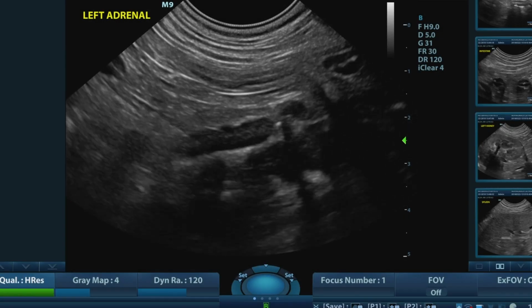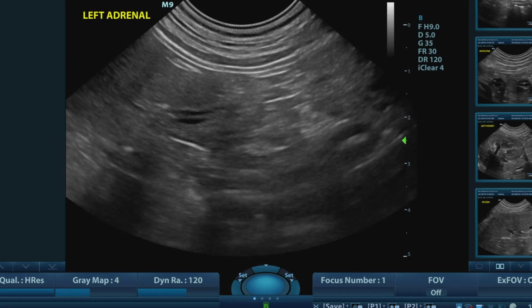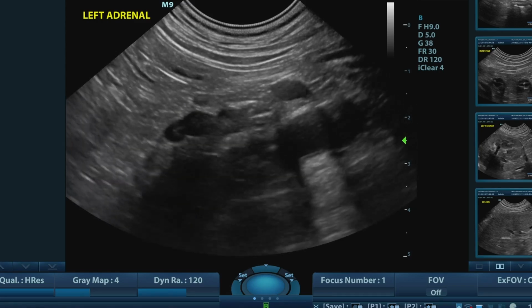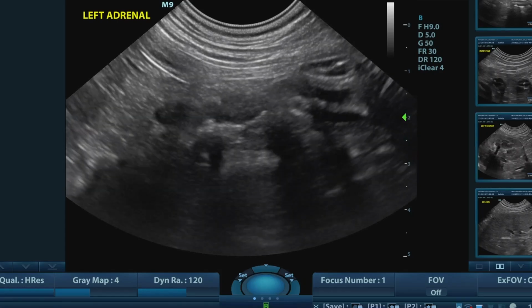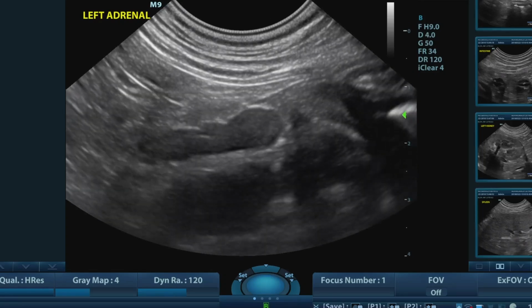All measurements are subject to operator error. Measurements of the same adrenal by one sonographer may differ from those of another. It is easy to have the ultrasound beam slightly off-center of the adrenal and to make measurements that are not at the widest part of the gland.